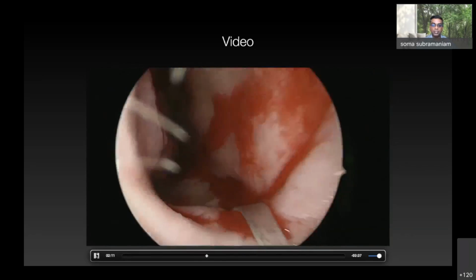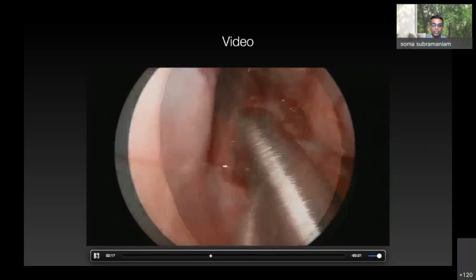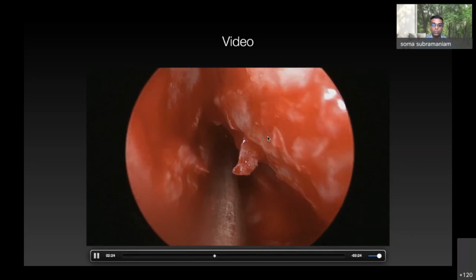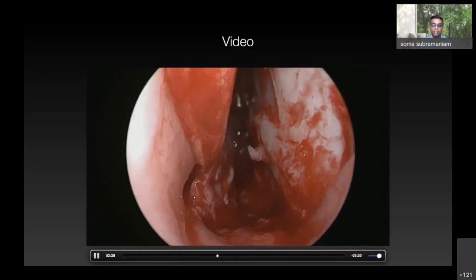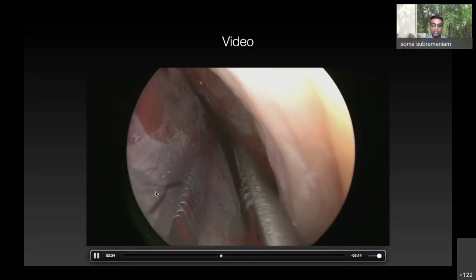So this is a septal incision extended onto the floor. Then we're raising off the mucoperichondrium, the mucoperiosteum of the contralateral side. This is along the floor on the right side. And now what I'm going to do is I've protected the septal mucosa on the right side. Place a silastic splint inside there to protect that from any injury.